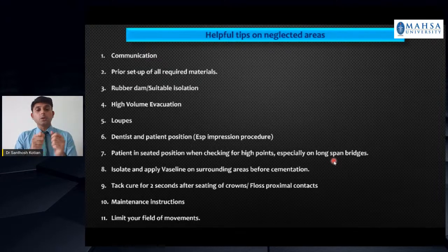When you're trimming the crowns, always trim them on top of a rubber ball and not on the open surface where it can drop to the ground.